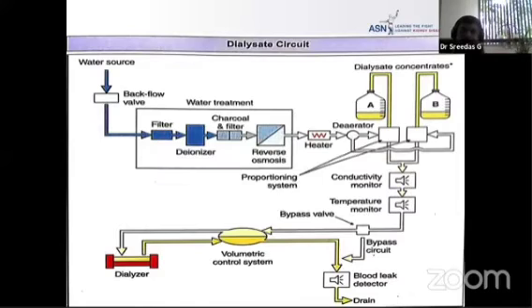So that much about the blood circuit. Blood circuit as such is a big topic and needs a special separate discussion. I would try to concentrate on the dialysis circuit because that is a black area among the DPs as well as the nephrologists. So we know there is a water source, and the raw water that is coming, we subject it to a water treatment plant.